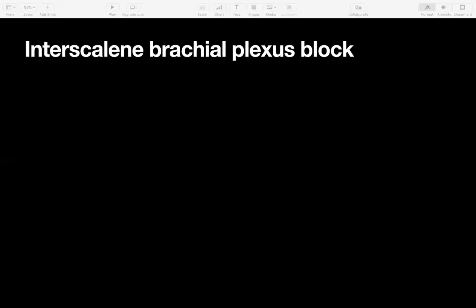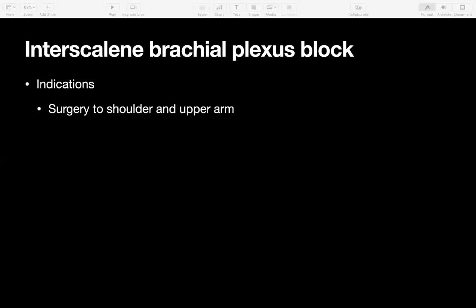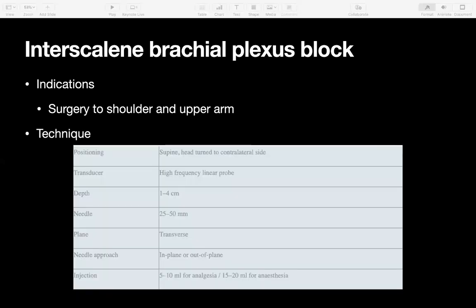First of all, the interscalene brachial plexus block. Indications would be surgery to the shoulder or upper arm. The technique involves a supine position, using a linear probe — it's a very shallow block — generally only needing about a 50-millimeter needle, in a transverse plane with an in-plane needle approach. The volume and concentration of local anaesthetic would depend on whether you're going for analgesia or anaesthesia.